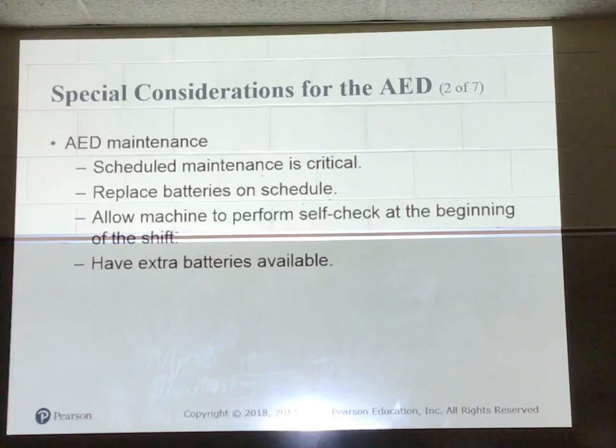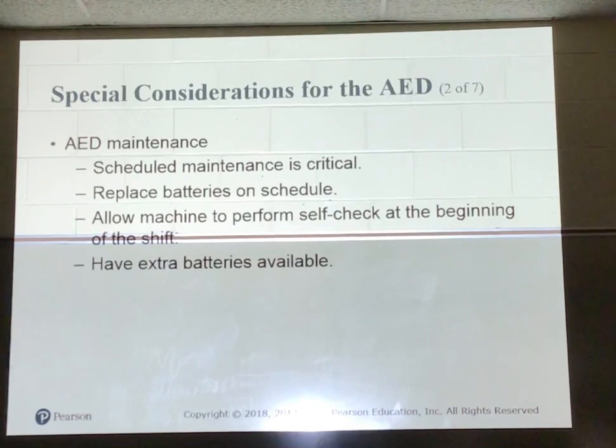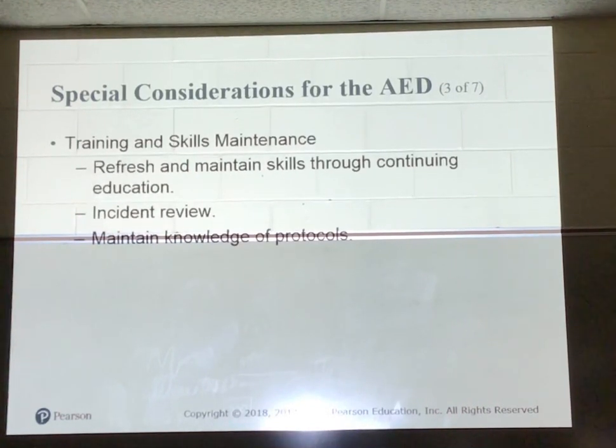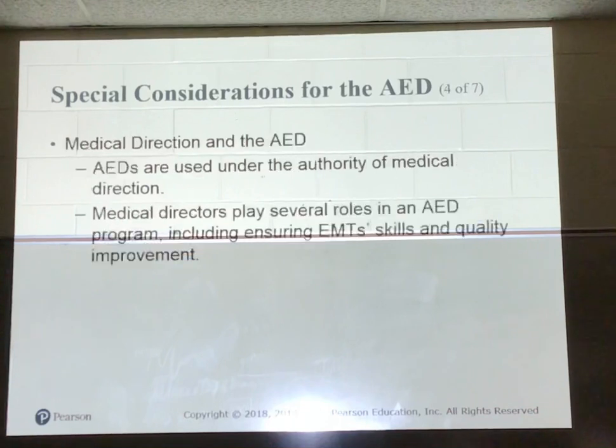Scheduled maintenance of your AED is critical. Replace the batteries on schedule. Allow the machine to perform the self-check at the beginning of the shift. Have extra batteries available. Refresh and maintain skills through continuing education. Have an incident review and maintain your knowledge of protocols.